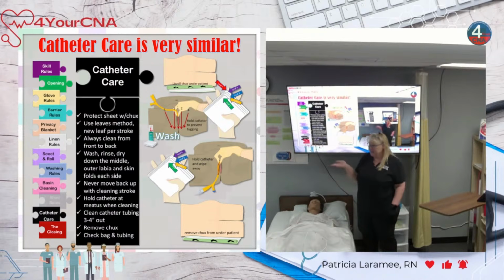Urine on the skin, no good. We got to get that urine off the skin. So PeriCare is front and back. Catheter care is front and tube. Do you guys see the difference there? The tube takes less time to clean than the backside. That's why you get less time. Okay? Other than that, I mean, you pretty much know this skill.